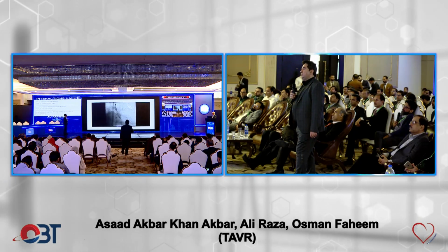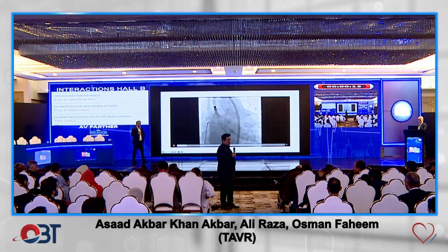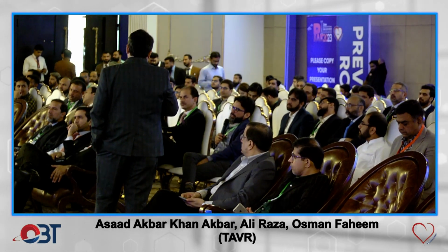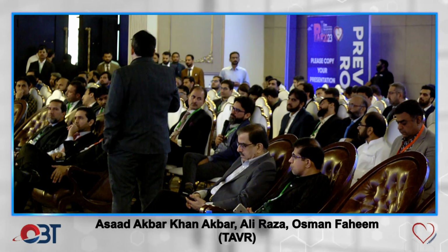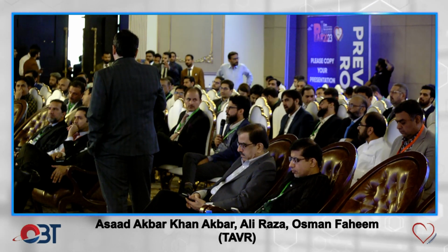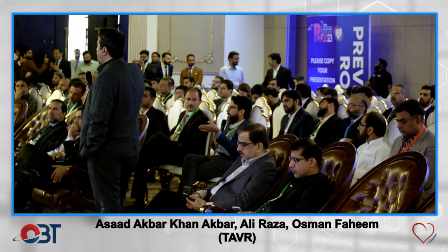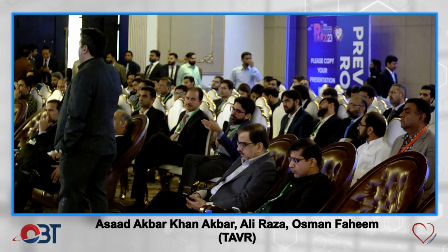See, I think in your initial experience, when you guys start doing this, parallax is going to be a term out there. But this cusp overlap has made life really easy. You start deploying the valve, the non-coronary cusp is the deepest most. So if you got the non-coronary cusp, automatically you have the other two cusps. Okay, so in the cusp overlap, if you are at or below the non-coronary, you don't have to worry about parallax because that's where you started deploying the valve.